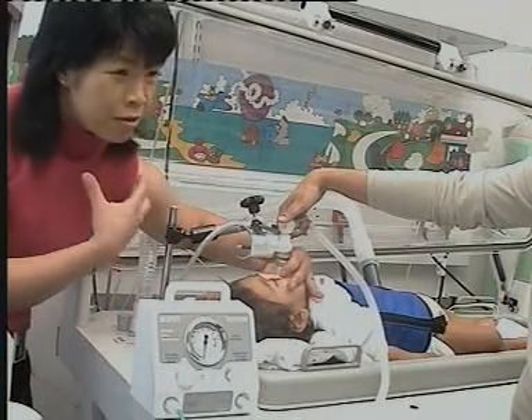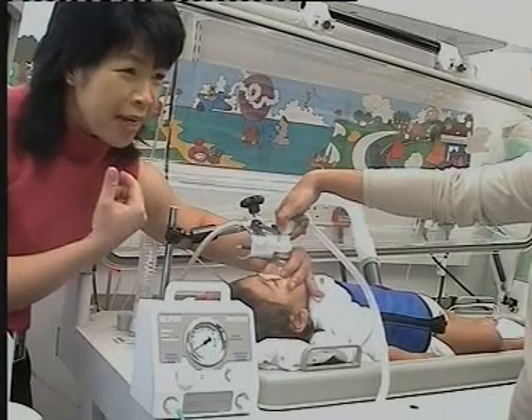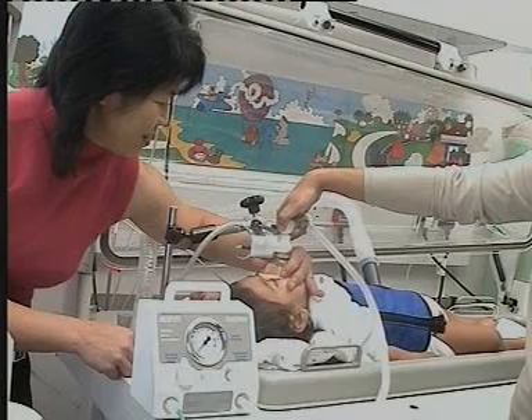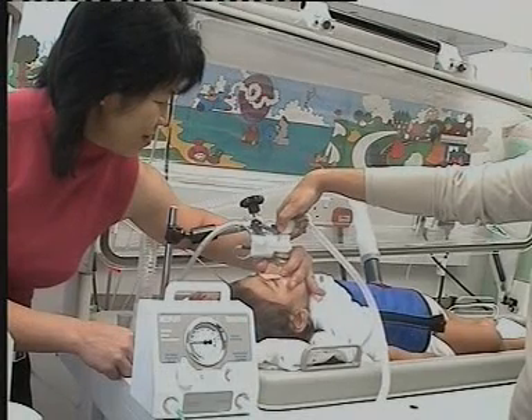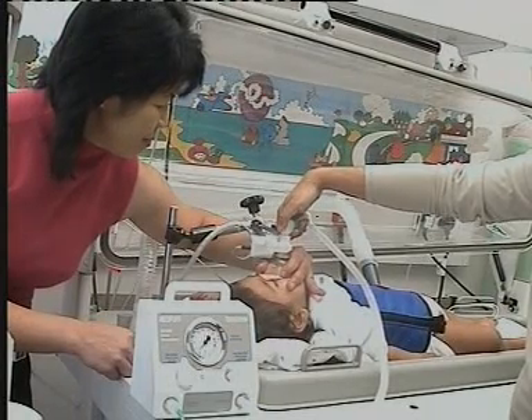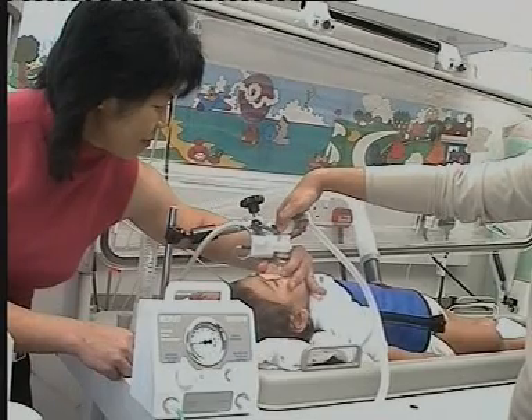We can obtain even more information by inflating the lungs towards total lung capacity to obtain a full forced expiratory manoeuvre. This is done by inflating the lungs with a pre-set pressure of 3 kPa before inflating the jacket to force expiration.